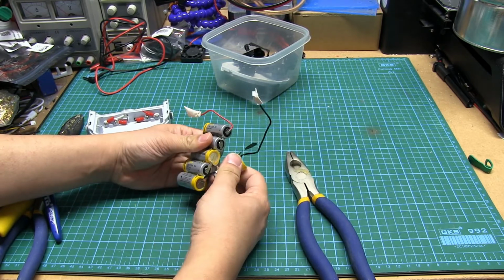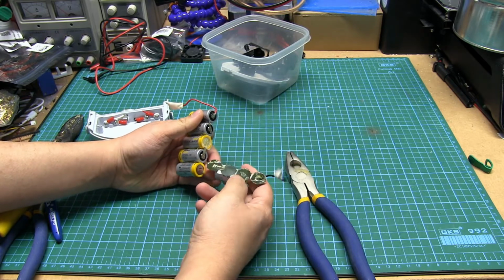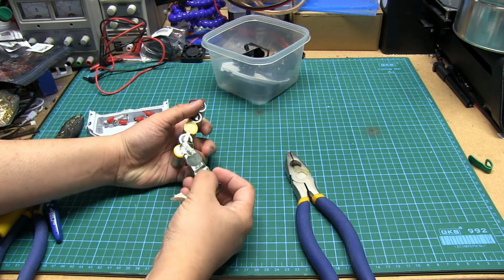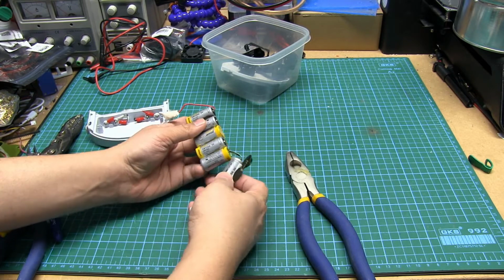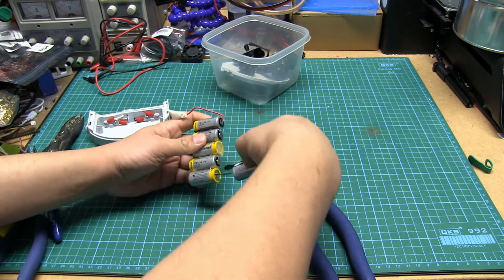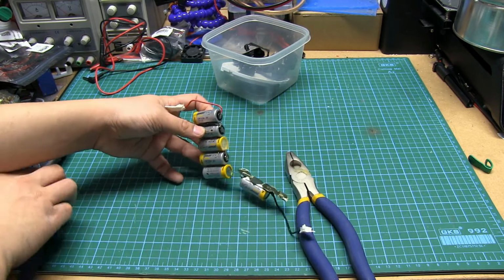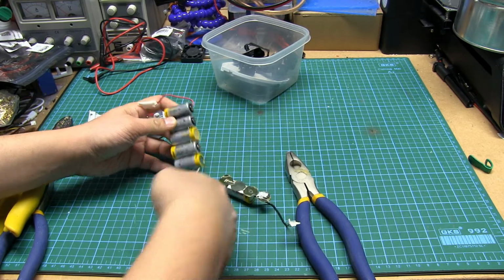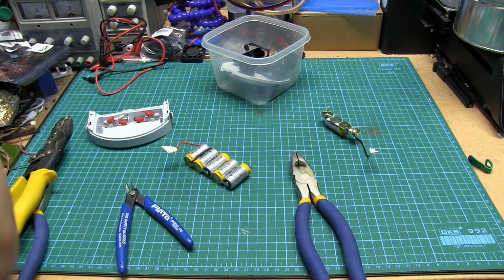Either way, we've got one cell here on top that is just, I guess, adhesive taped on. You've got a fiberboard insulator custom cut to the shape of the cells for 4 of them. So this cell is just in series like the rest of them. It's just folded over for compactness in the shape. I am, however, going to snip this one off and see about ripping the welds off of these and salvaging them. Let's take a look at the voltage, though.